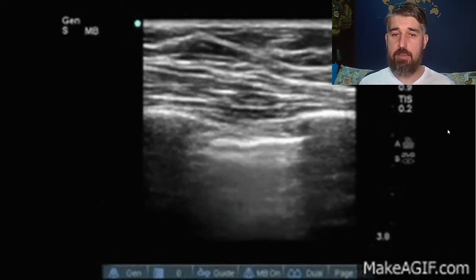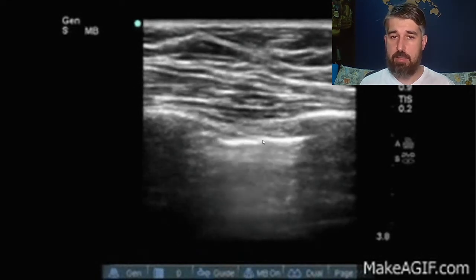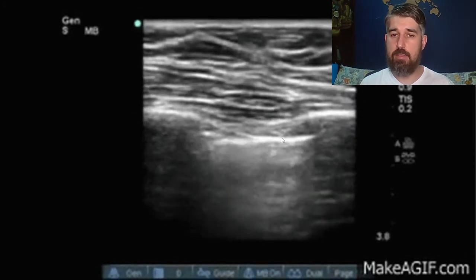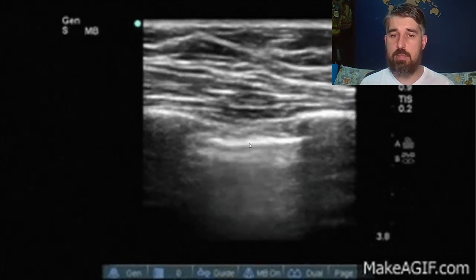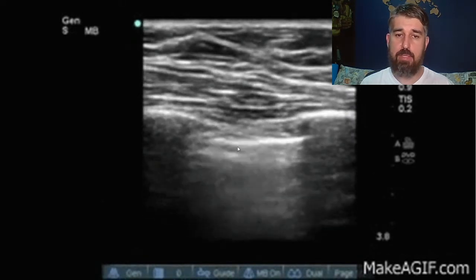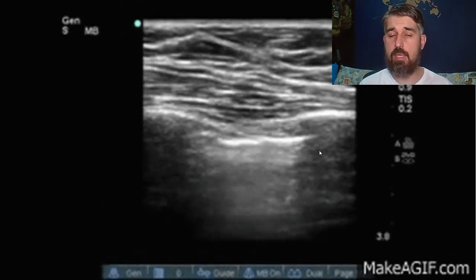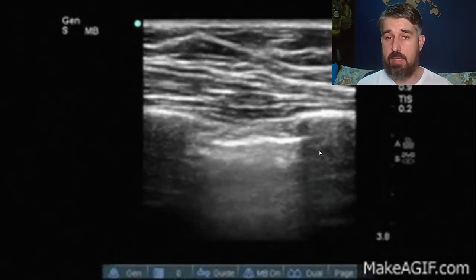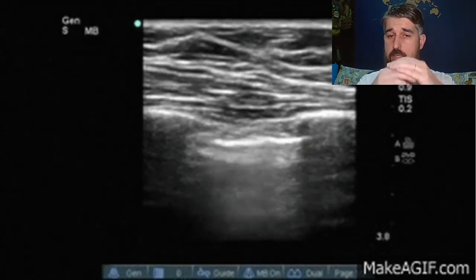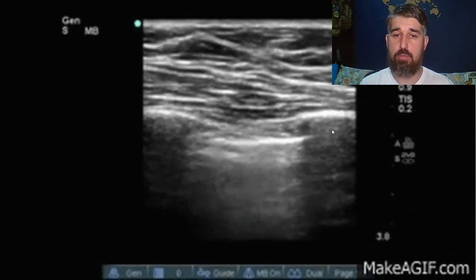And here we have the ribs and the pleura, and here we see some movement, and here it's still. So this is the lung point. This means I have healthy pleura here, one sliding over the other, and here we don't have the sliding. In this case, we are talking about trauma. This means we have a pneumothorax. It means we lost the contact of the two pleuras.